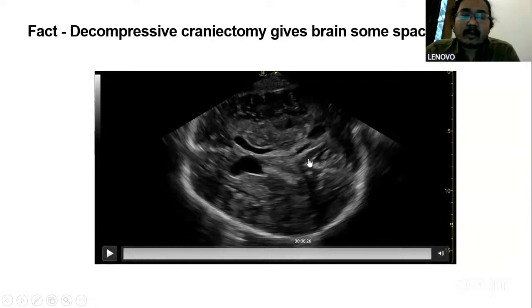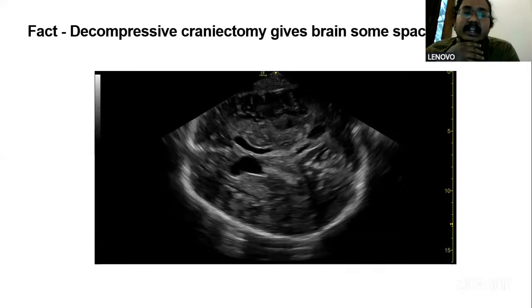The anatomical detail would be as great as a CT scan. But the problem with TCD and cranial ultrasound is it can just give you an idea and you need to confirm it with CT scan or MRI whenever there is a doubt. So these two things are what we are trying to do in our post-operative cases, and see how the patient's clinical course is.